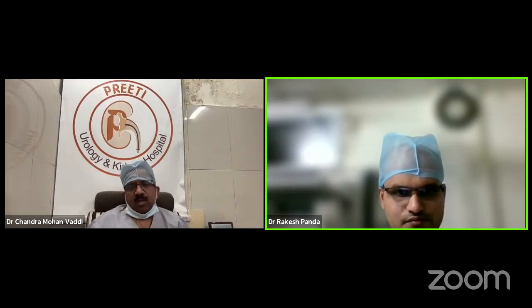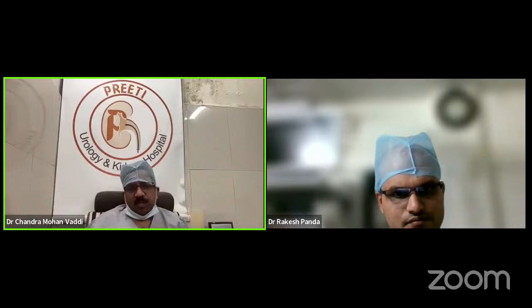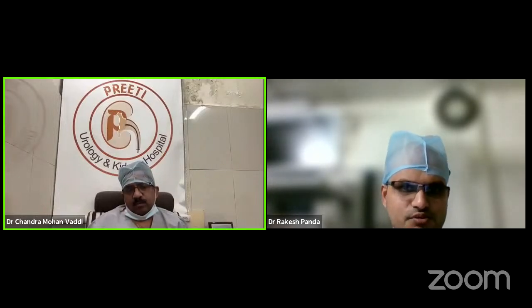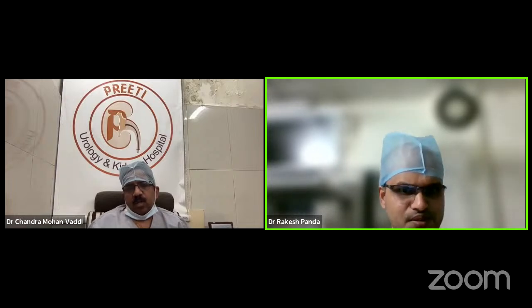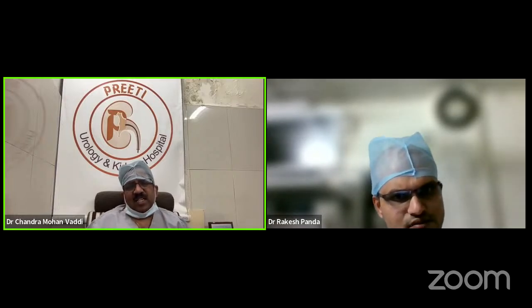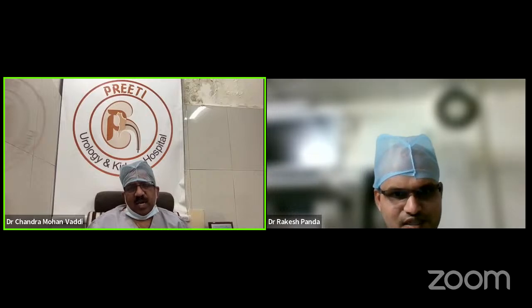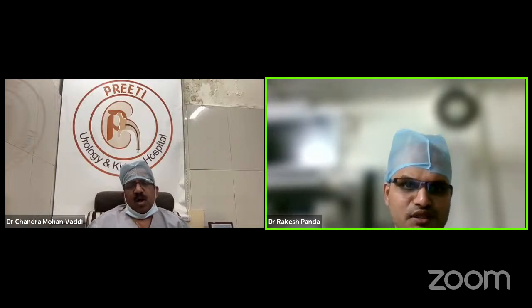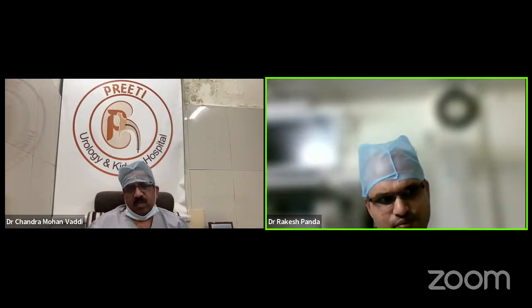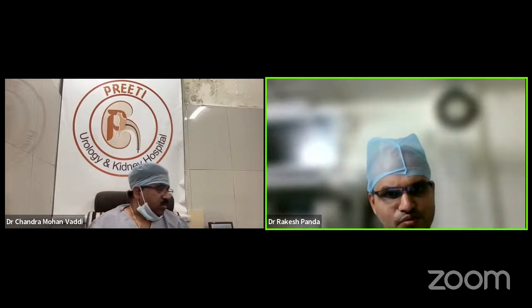Radiation, do you think there is some difference between supine and prone? Yes, sir. Radiation exposure is very less in supine PCNL because we stay away from the patient. But the majority of PCNL surgeons don't use C-arm that much, except the juniors. Or you can stand away also. And one more thing, in supine PCNL the fragments come out on their own.